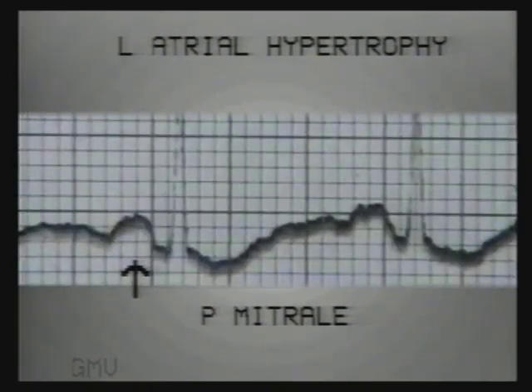This is another P mitrale — not notched, but 3 small squares wide.